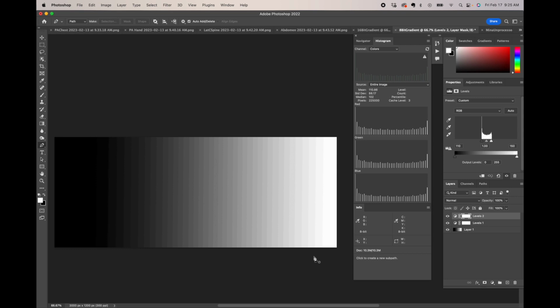If you remember Pascal telling us in class that digital images naturally have a lack of contrast, they need to be adjusted. It's the same concept. A JPEG is also a compressed file format, and anytime you compress something down, you will degrade the quality some.